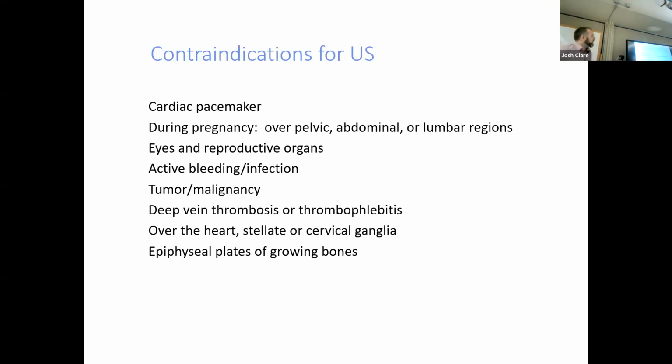So some contraindications: cardiac pacemaker, during pregnancy. Different sources have different rules for pregnancy. Some say any pregnancy, any ultrasound is contraindicated. Others say, well, you can be pregnant, just don't use it over the pelvic, abdominal, or lumbar region, staying away from the growing baby. So if somebody had an ankle sprain and was pregnant, you could do it to the ankle sprain. Some textbooks have different guidelines for that.